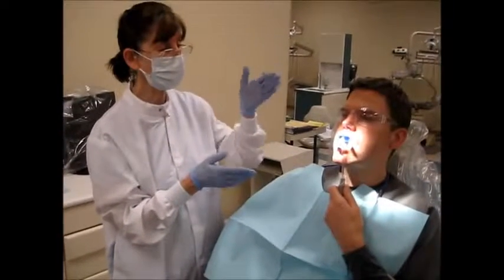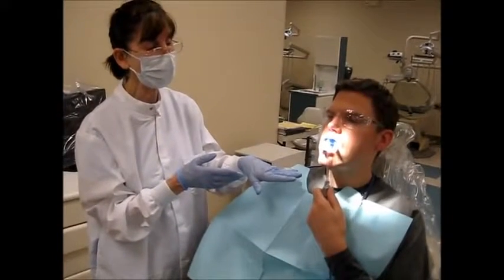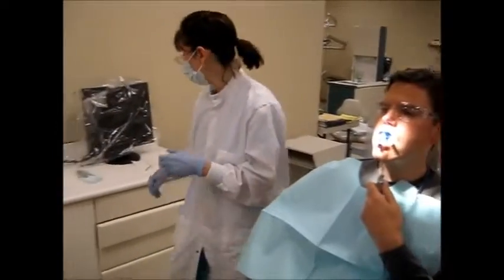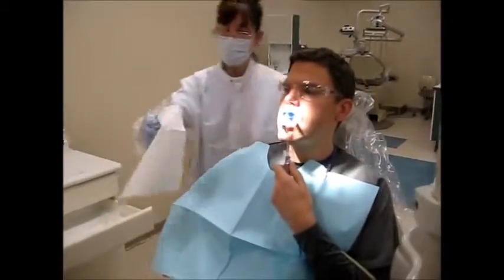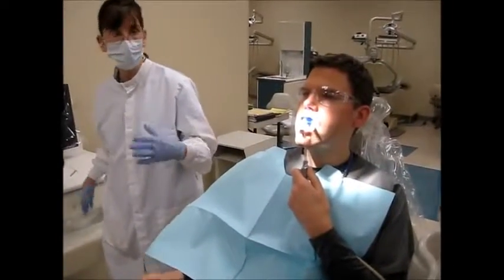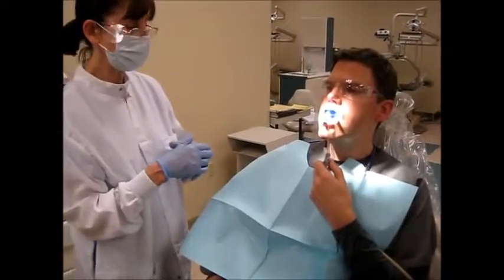See that the patient is upright in this position, breathing through the nose, chin is down, and the patient is not going to swallow. The other thing that I would do is obtain a paper towel for the patient with an overglove on and give this to the patient in the event that there would be any puddling or pooling of the fluoride or salivary flow.